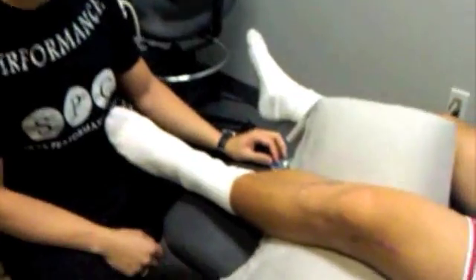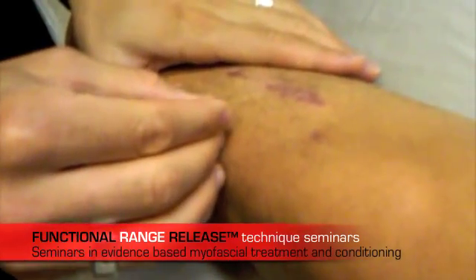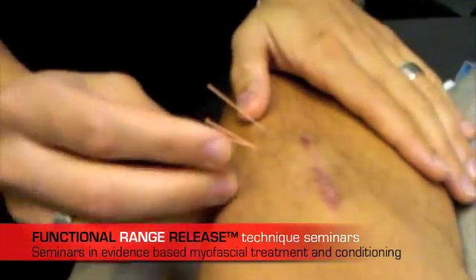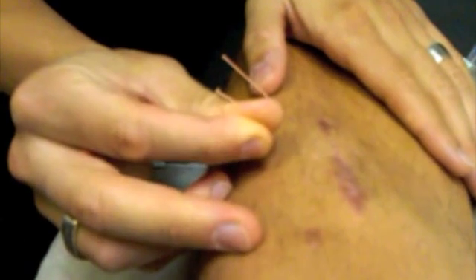So if you just zoom in here, one technique that we use for scar mobilization in addition to functional range release is myofascial needling. I've inserted the needles in and around the scar tissue. Now you'll see here — if I twist the needle and coil the tissue around it, I can't really twist the needle anymore.